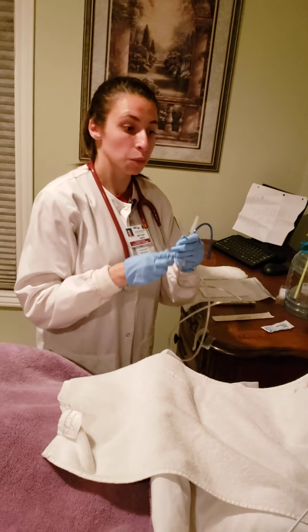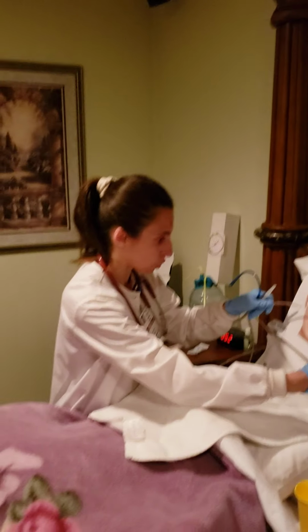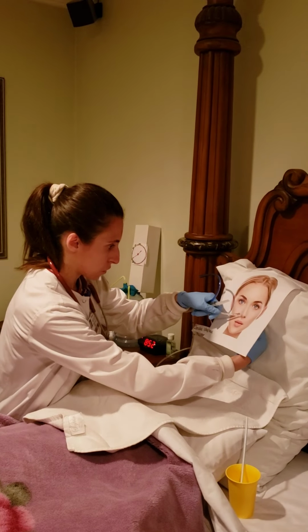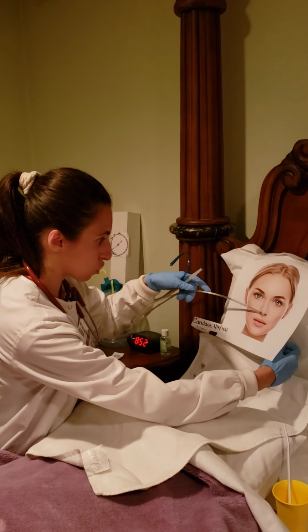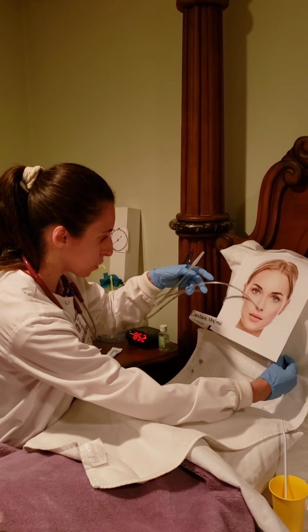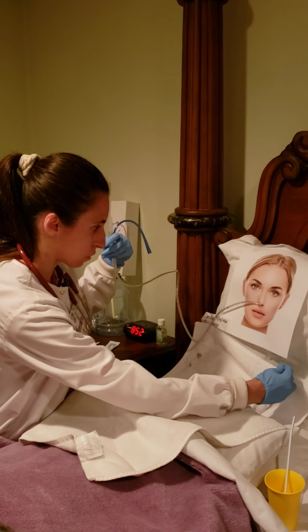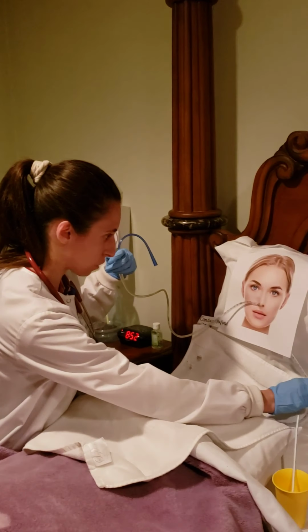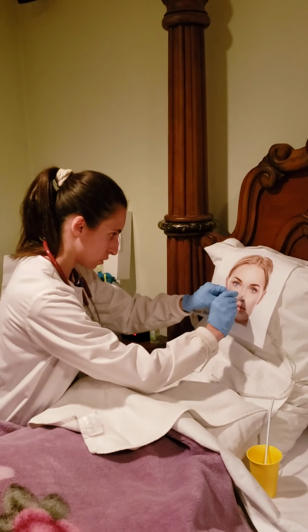Okay, Miss Carmel, I'm about to go in, okay? I want you to look up to the ceiling. Can you do that? Yes? All right, here we go. All right, Miss Carmel, I'm going in. Can I have you look down to your chest and start taking sips of water for me? Good, Miss Carmel. Pain or discomfort? Yeah, it's a little discomfort. I feel you. All right, Miss Carmel. We're here. We're here.